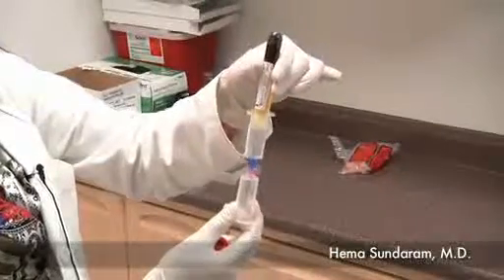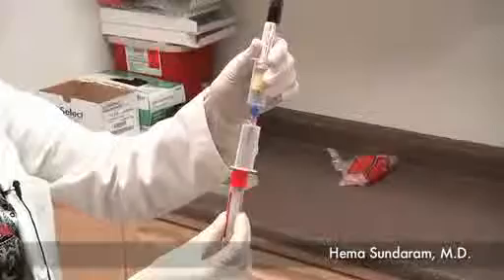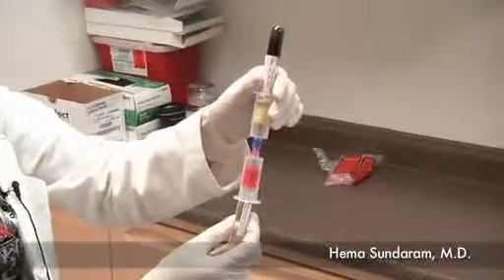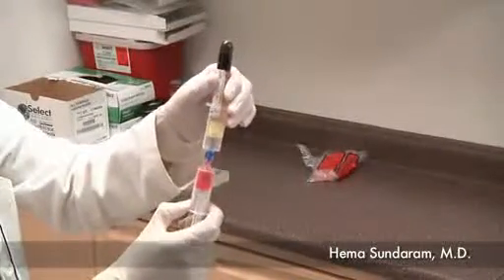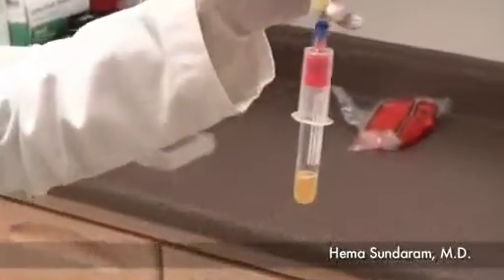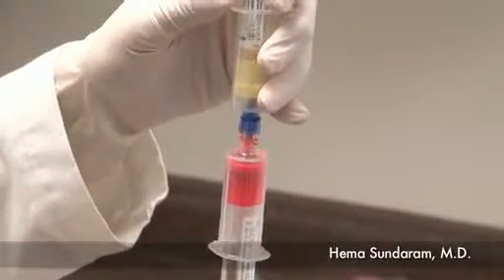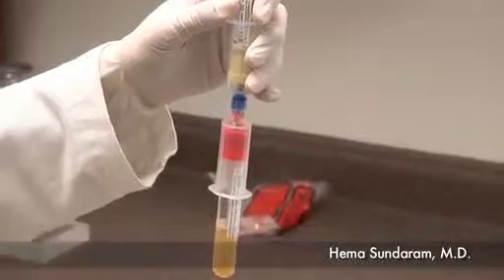The tube of spun blood is placed in the transfer device, and then the red tube to which the supernatant will be transferred is placed also in the device. And we can see now the platelet-rich fibrin matrix is being transferred into the red top tube.